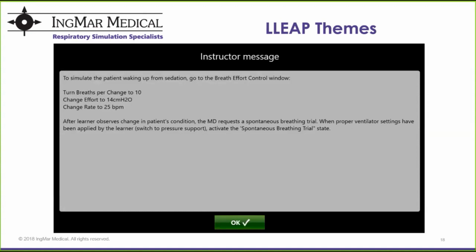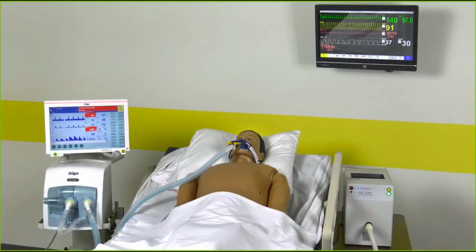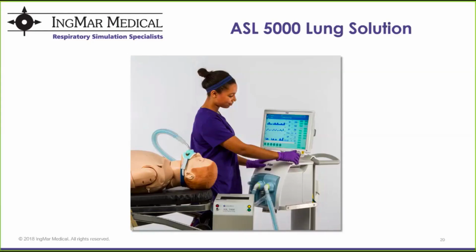In this way, we're able to build the story around the breath patterns while providing the student with the most comprehensive and immersive learning environment possible. When you bring it all together, you have a high-fidelity mannequin simulator, which can be intubated and placed on a real ventilator for hands-on training scenarios. Our goal is to make the learner feel like they're in a real ICU, faced with the anxiety of treating a critically ill patient on a ventilator.